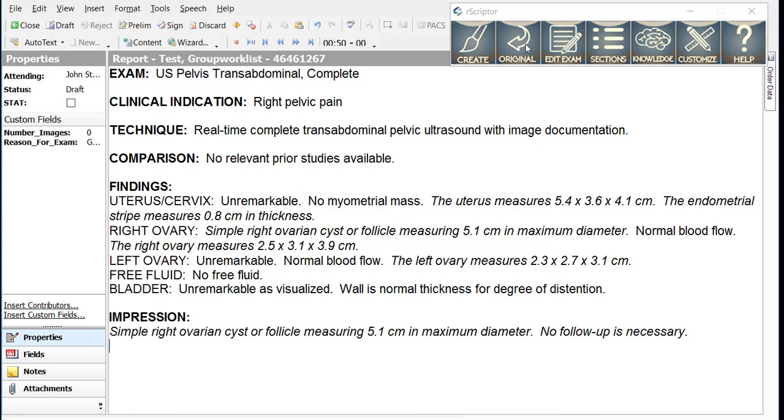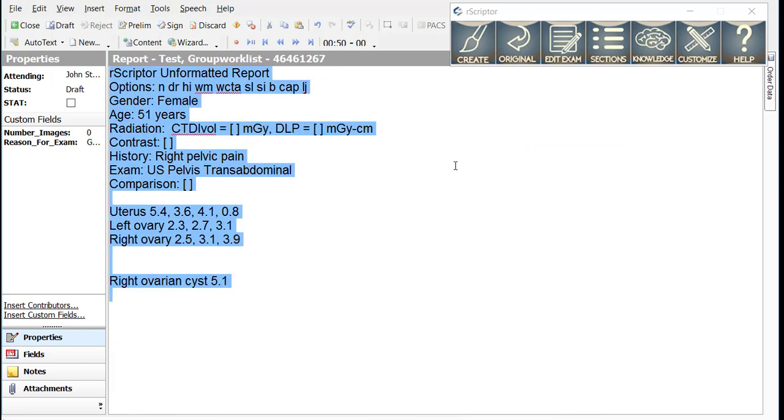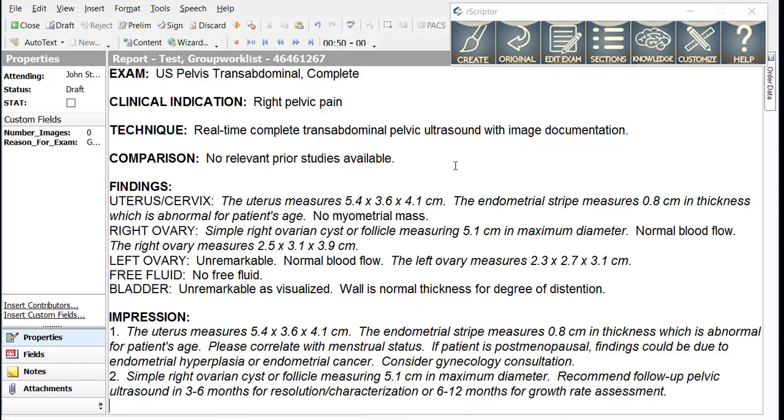If we go back to the original report and I simply change this from a 21-year-old to a 51-year-old, you can see that the smart macros in this case will change. Not only is there a different recommendation for ovarian cyst follow-up in a 51-year-old, but R-Scripter is smart enough to recognize that this endometrial stripe thickness is too large for a patient of this age.